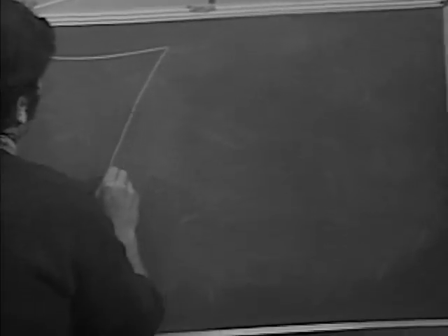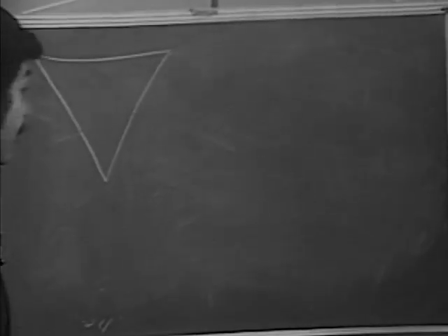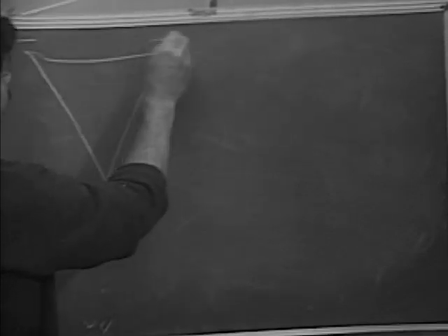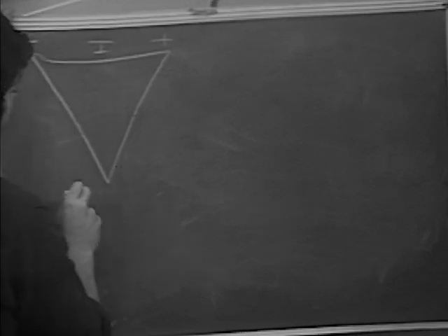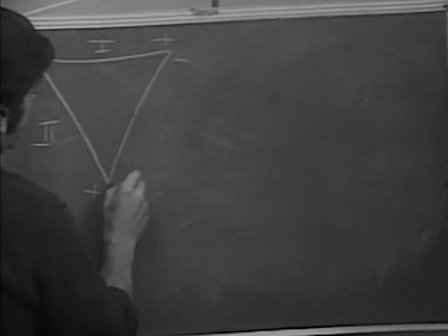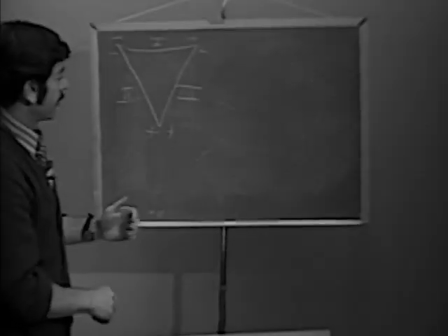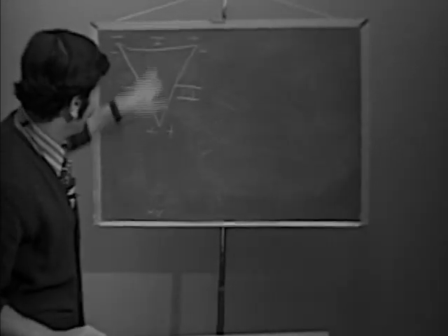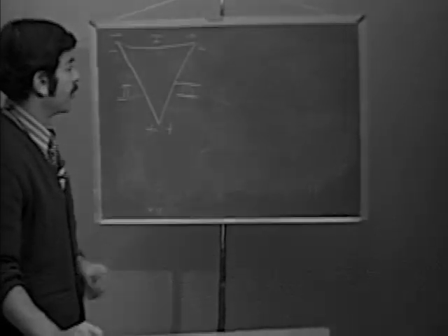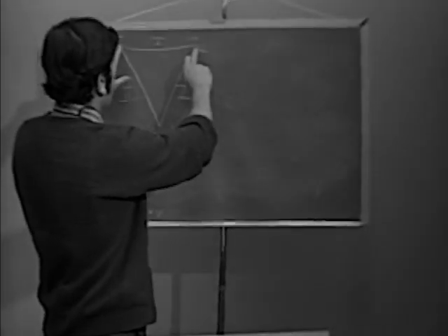So everybody knows what that animal is. That's Einthoven's triangle, right? And it's set up so that we're going from negative to positive. So this would be lead 1, negative to positive. Lead 2, negative to positive. Lead 3, right? And if you're like me, I always used to get lead 2 and 3 mixed up. I could never remember which one on which side. Well, let's see if we can straighten that out or get a way to remember that.